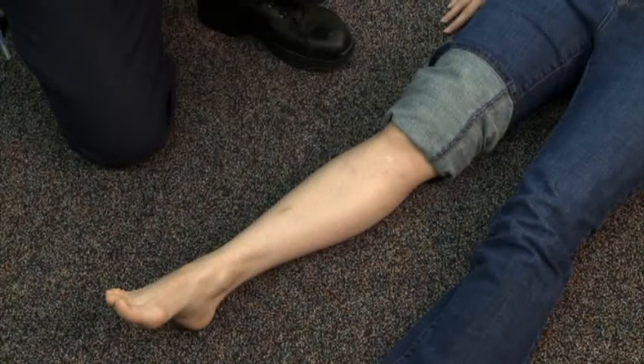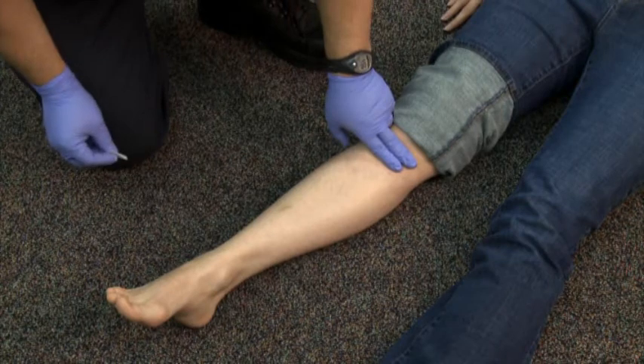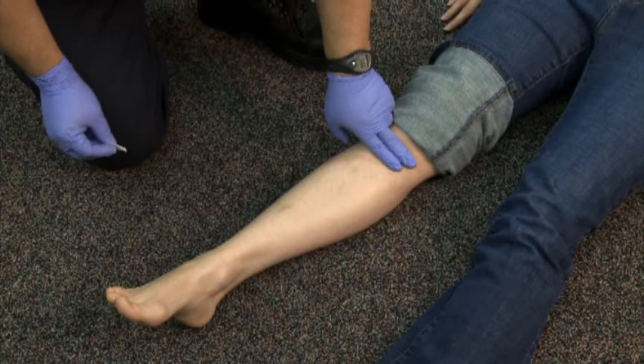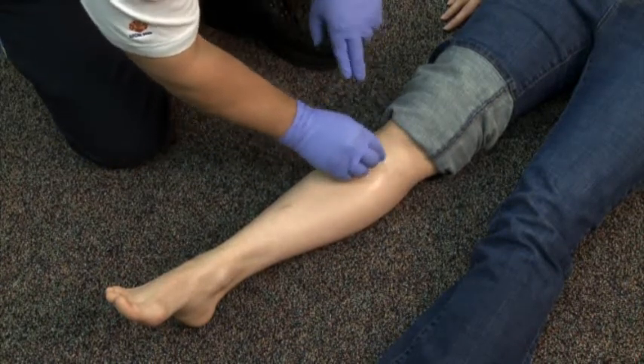Assure proper body substance isolation, or BSI. Identify the proper landmarks. For the tibia, it is the anterior medial proximal tibia just below the tibial tuberosity. The insertion area is cleaned with an antiseptic.